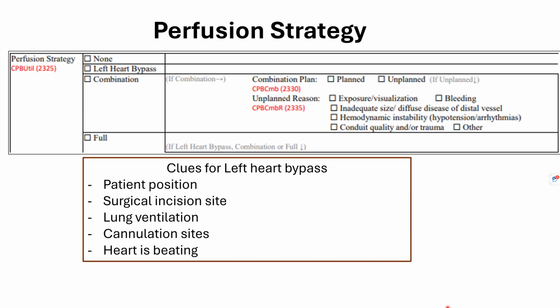And as I mentioned, nowadays I have not coded a left heart bypass for almost 1.5 years now. They used to do it, then they again stopped. So that's why I said in the beginning, if they don't do it, you don't really need to think too much about it. But there can be one surgeon who wants to do it, or that one case where the repair is not possible without bypassing it.